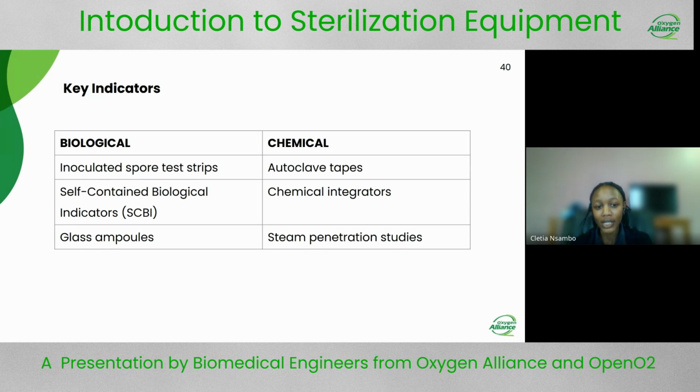Well, when it comes to chemical, you use chemicals. These chemicals typically change color depending on the type of parameter, depending on the set. For the chemical ones, you might have multi-parameter or a chemical that actually measures that type of parameter. For example, you want to measure your parameter.